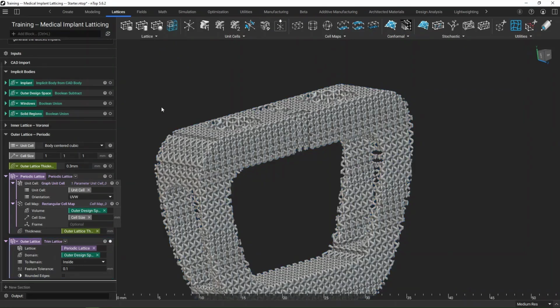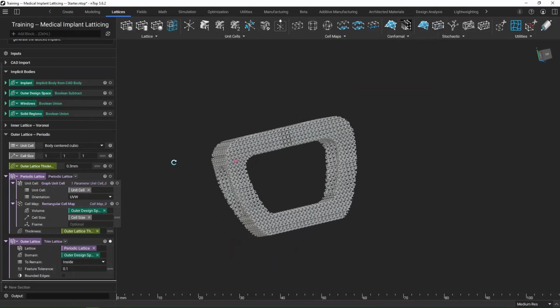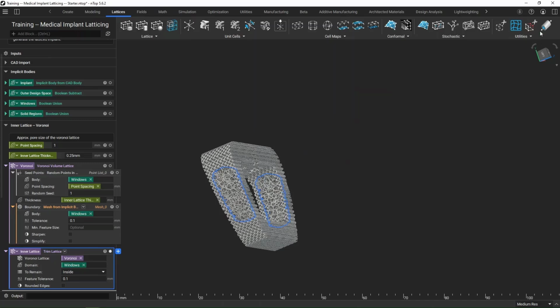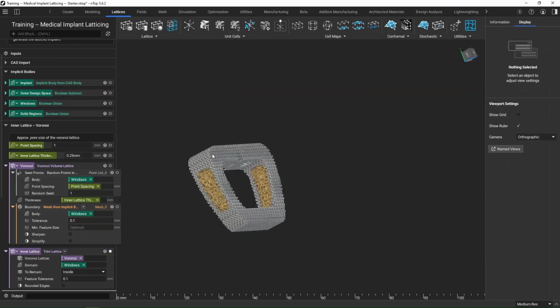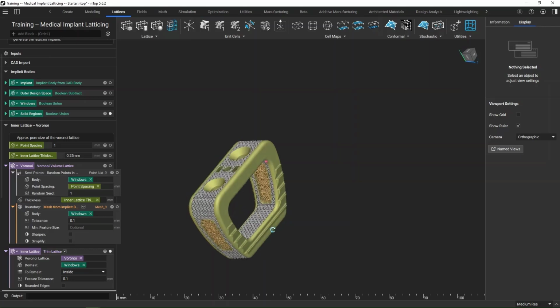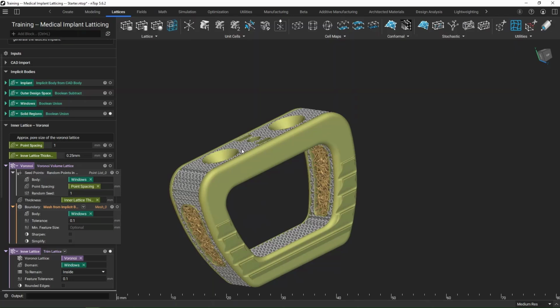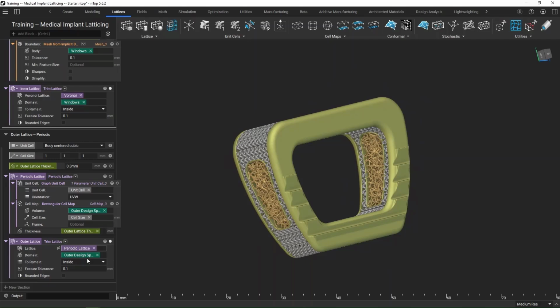So as we can see, I've got my outer lattice. I've got my inner lattice. Actually, maybe we want to make this into a different color. So let me go over to the display so you can kind of see the different elements that we're working with. And then I've got my solid region. So those are all the bits that we were playing around with. But right now, technically, they're all separate. We've got 3 different items that we're playing with.